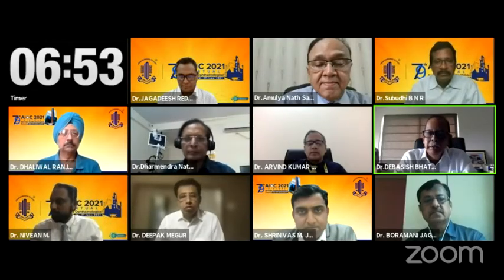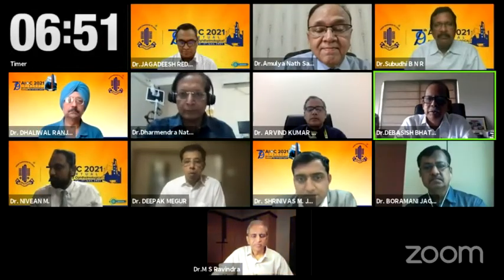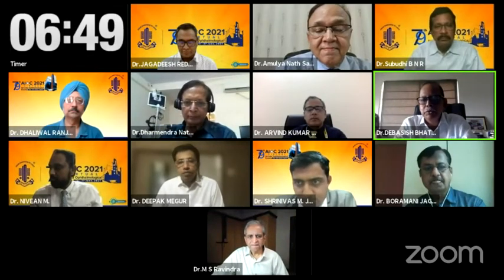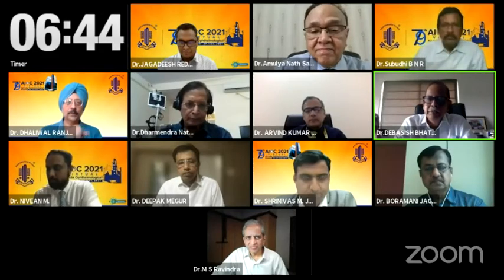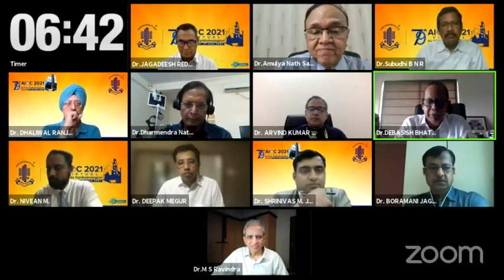Yeah, Srinivas, it was wonderful, as expected by the people who really do SICS. Dr. Deepak Meghur gave us a very good demonstration of the bimanual prolapse of the nucleus through a 5.5 millimeter rexis, and definitely it helps a lot.